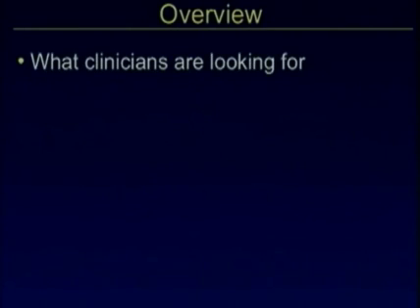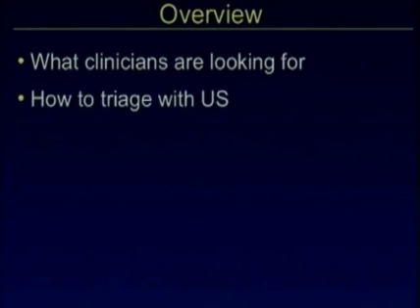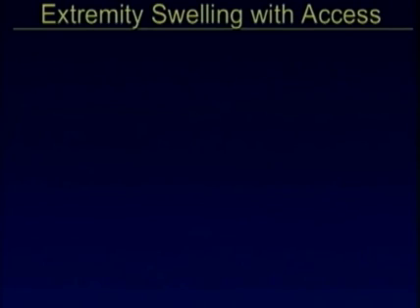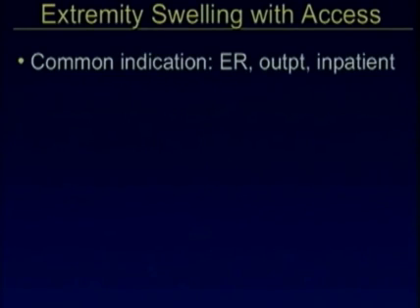We're going to talk today about what clinicians are looking for in the swollen extremity, how to triage with ultrasound, and a brief slide on billing because it's very important. You need to bill exactly what you do. And then we're going to go over the focal findings that you will see, both common and uncommon, and show examples.